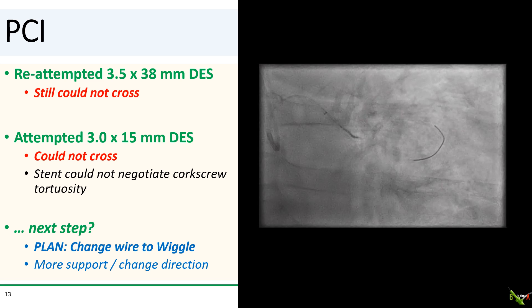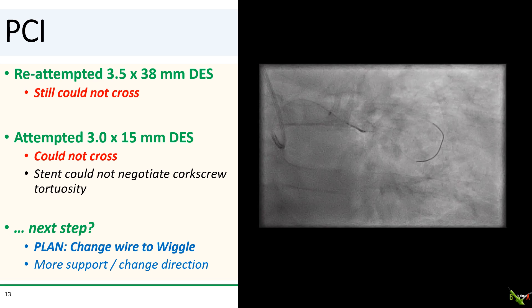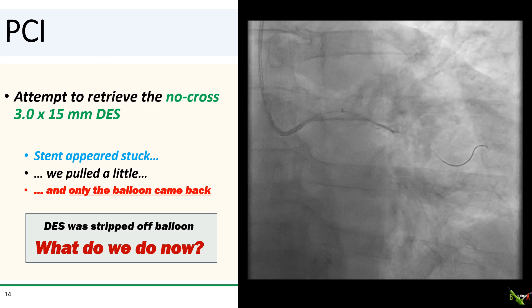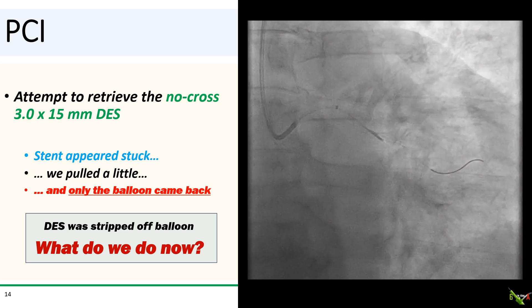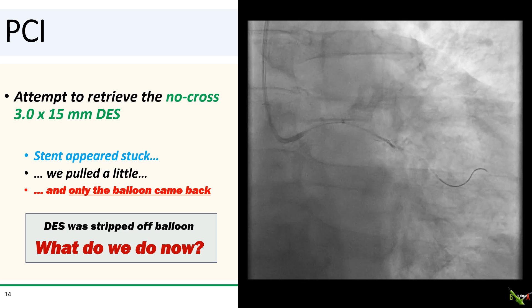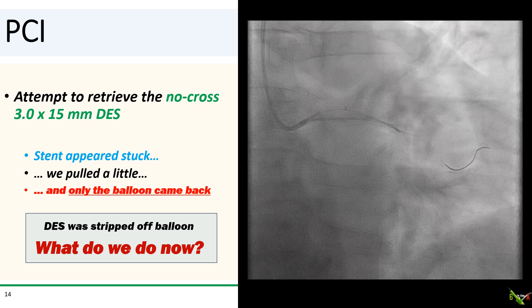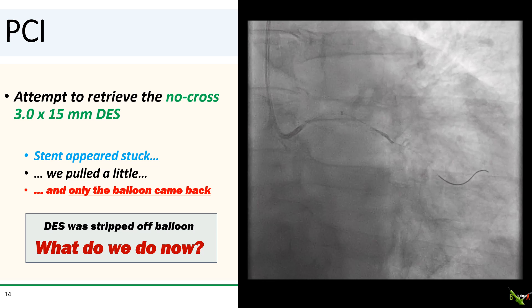So what next? My plan was to swap out the pro-water wire to a wiggle wire. The wiggle wire will provide more support and the wiggles will allow us to direct the tip of the stent in different directions, allowing us to better negotiate the tortuosity of the lesion. But this is when things went really wrong. As we tried to retrieve the no-cross stent, it appeared to be stuck in the lesion. We pulled a little harder, and to our great dismay, we saw that only the balloon came back. The undeployed stent was still in the lesion and was completely stripped off of the balloon.